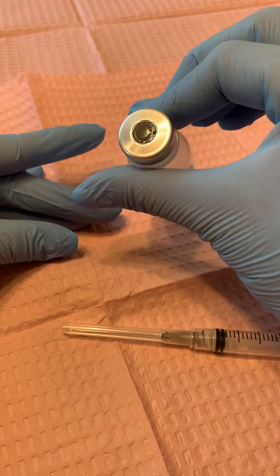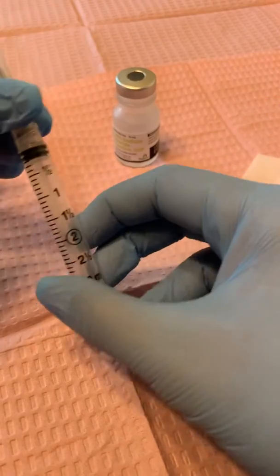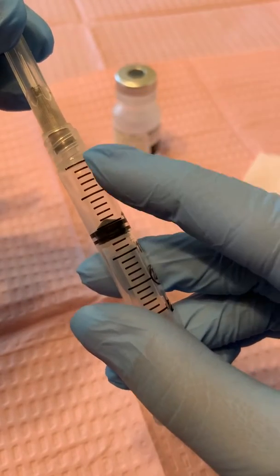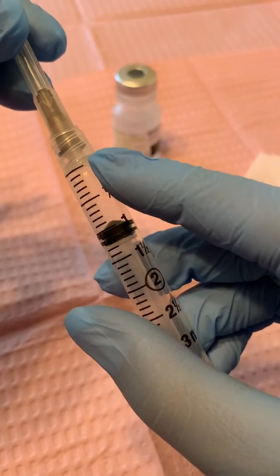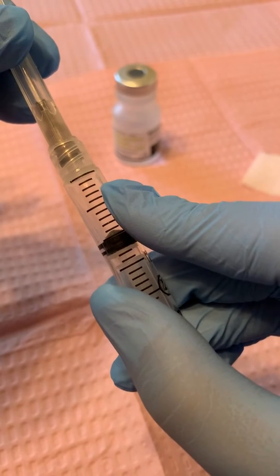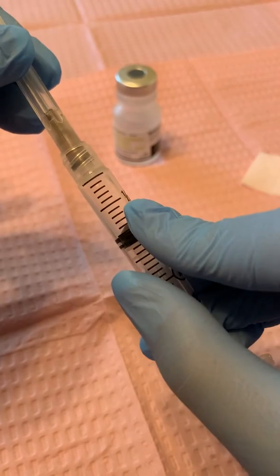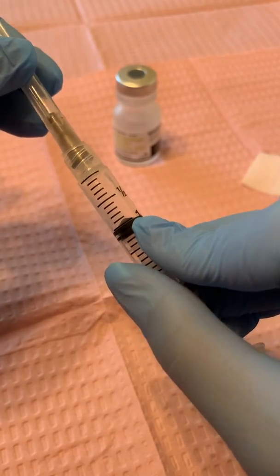Remember, alcohol dries pretty quickly, so while that dries I'm going to get my syringe. Make sure that it is luer locked. Our desired dose today — we're going to go ahead and draw to one cc or one ml. You have the first line — that line you do not count. So you count from this one, and it goes 0.1, 0.2, 0.3, 0.4, 0.5 which is the half. Remember 0.5 is the same as half. Then we go 0.6, 0.7, 0.8, 0.9, and then to the one.